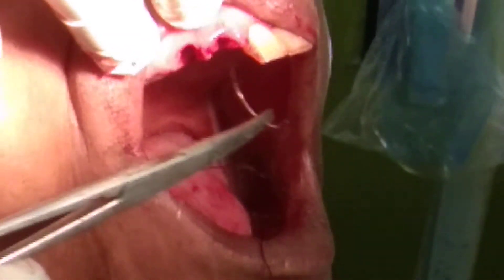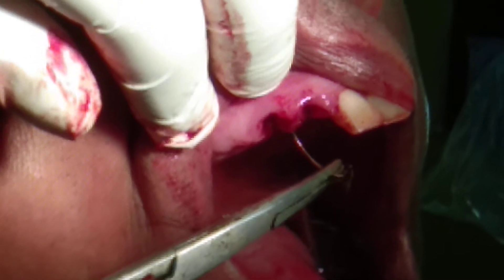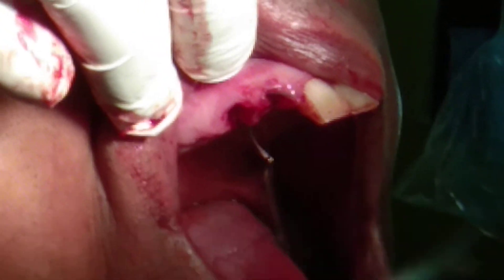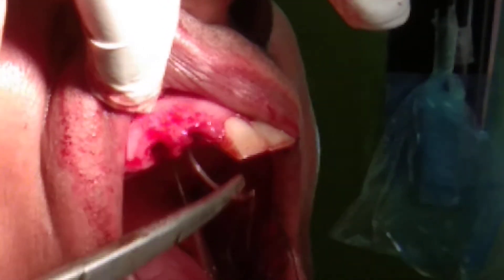And after that I will use a suture. This is a needle holder and this is why I am using a silk suture. So in this interdental area, this is actually the area which we are supposed to suture. Most commonly used suture is the simple interrupted — I am also going to use the same thing.